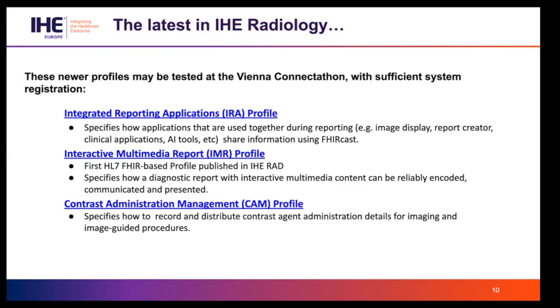And the contrast administration management profile deals with interoperability in exchanging the contrast agent administration details. Next slide.